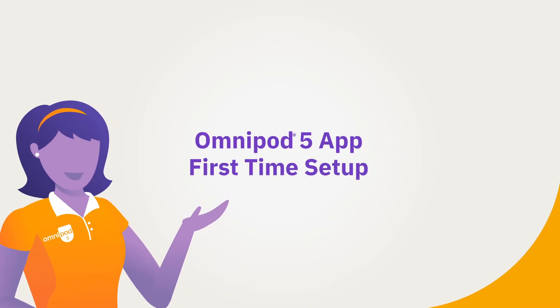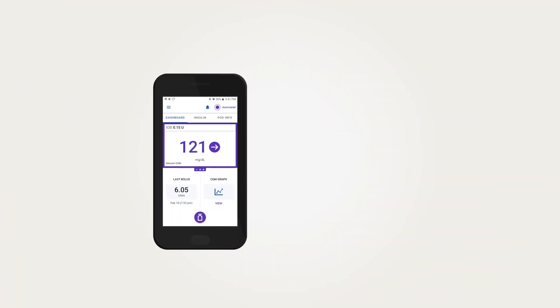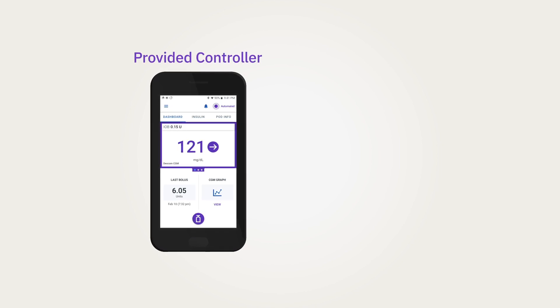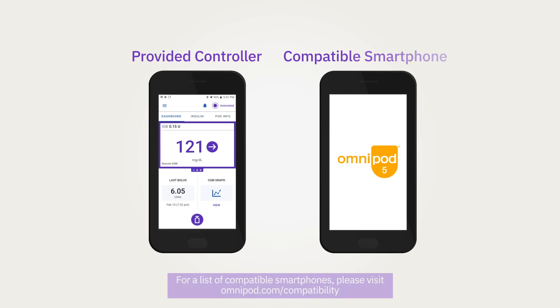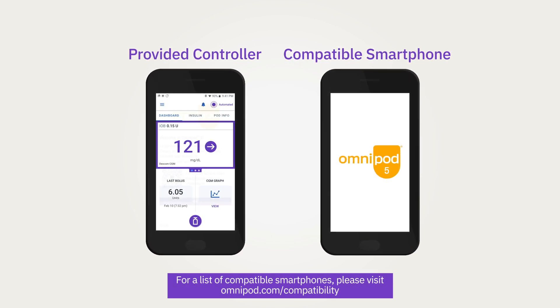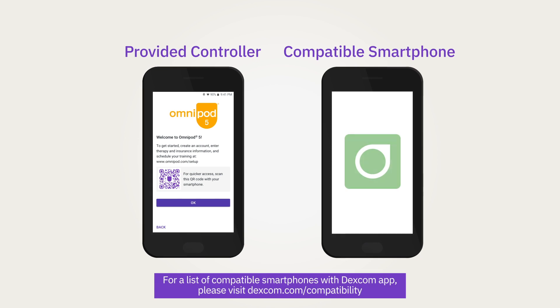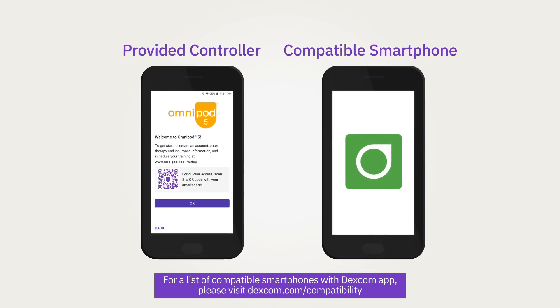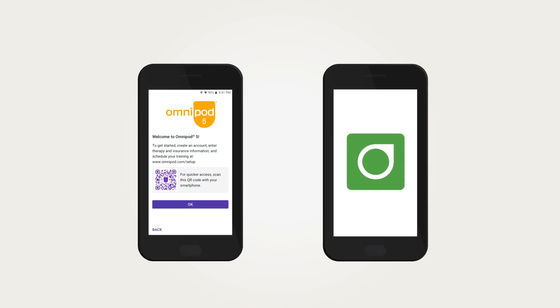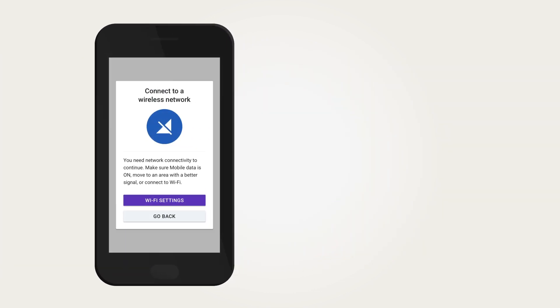Omnipod 5 app first time setup. With the Omnipod 5 system, there are two ways to use the Omnipod 5 app: on the provided controller or on a compatible smartphone. Depending on which you choose, your initial setup instructions and screens may vary slightly. With either method, you will need to download and use the Dexcom G6 app on your own personal smartphone. Use this course to guide you through first time setup, or refer to it later when you are ready.